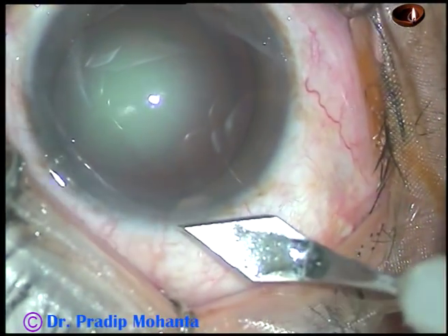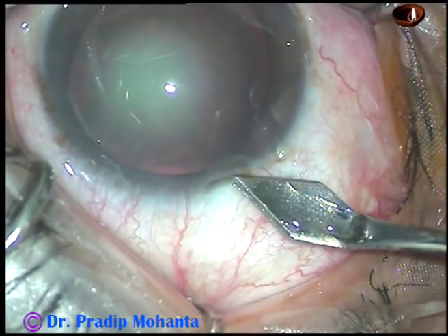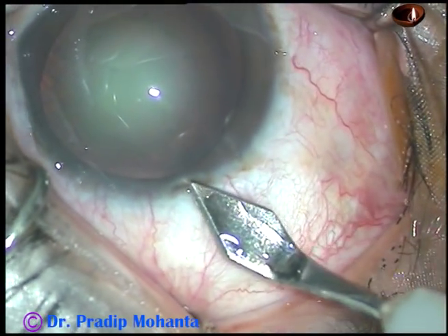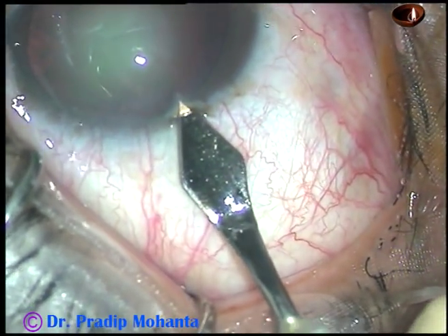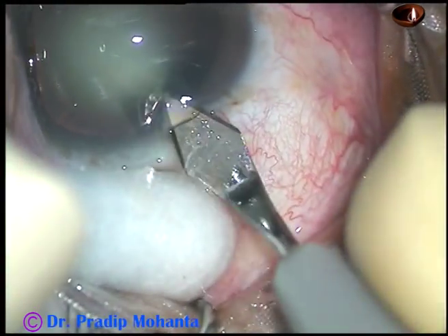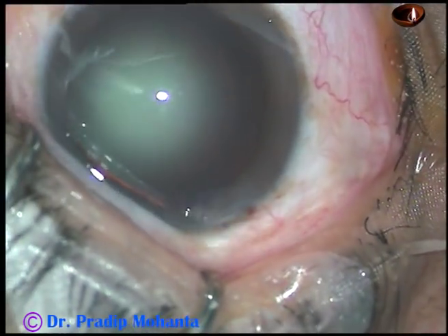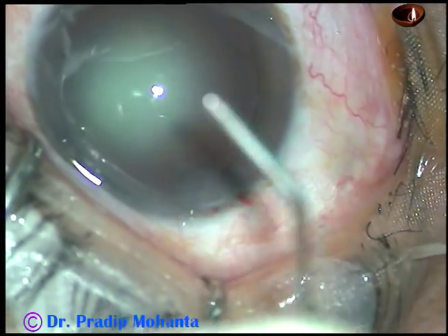This cataract is likely to be a posterior subcapsular cataract, but we cannot rule out posterior polar cataract. So in this case, I have decided to do NO-HYDRO Phaco, that is phacoemulsification without hydrodissection. Let us observe the surgical steps.